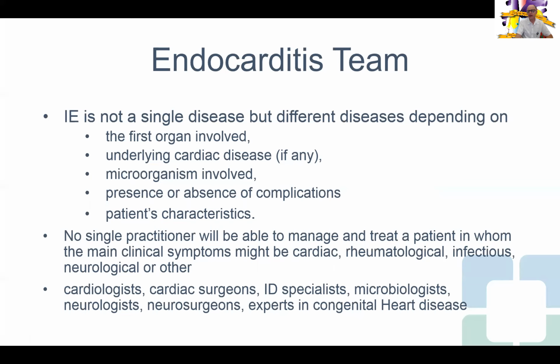This is, again, a team specialty in the modern era, requiring not only basic imaging but also advanced imaging, and you should rely on your colleagues who know how to read CTs, MRIs, nuclear echoes, advanced echo, and so on and so forth.